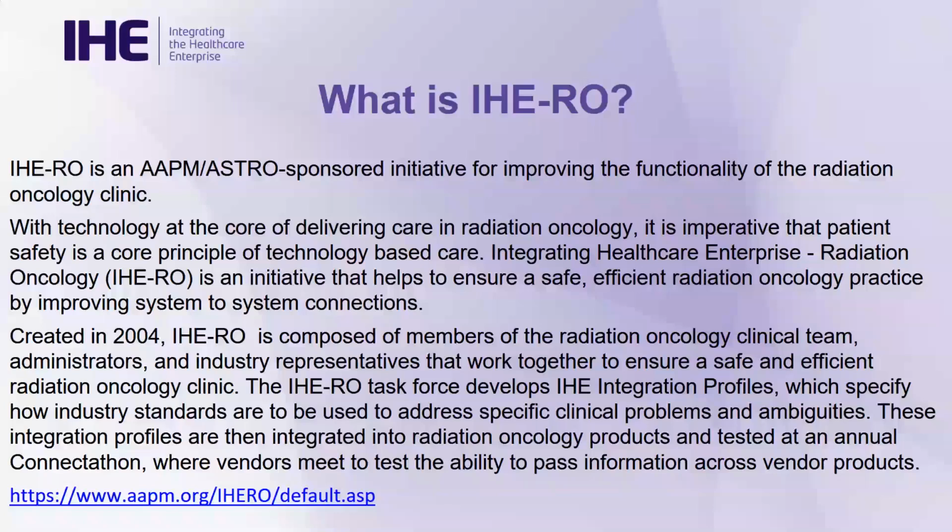So what is IHE-RO? It is simply the application of IHE to the radiation oncology clinic. One of our big reasons for doing this, and actually the main reason, is patient safety, to make sure that when we transmit information electronically, it is clearly understood what is being sent and what is being received, and that the people using both systems fully understand what the information is.